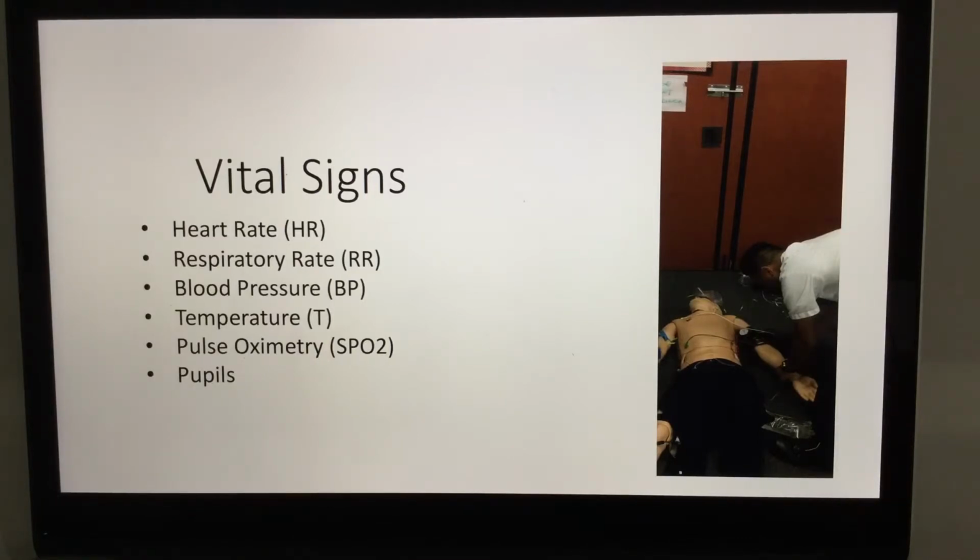We're going to pump and inflate the blood pressure up, making sure that our release valve is tightened and closed. We're going to keep our finger on the pulse, that brachial pulse, as we pump up until we no longer can feel a pulse. Now, if you've pumped it up to 120, we're going to pump it up 20 millimeters of mercury more, or 20 increments more. So 120 plus 20 is 140.